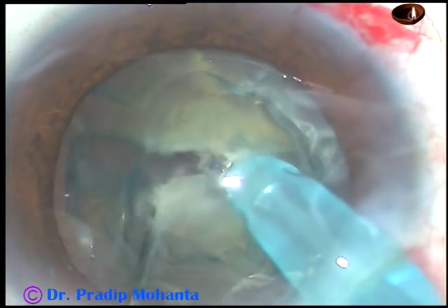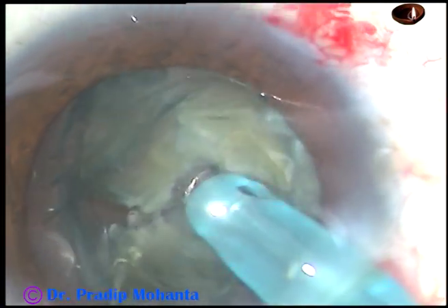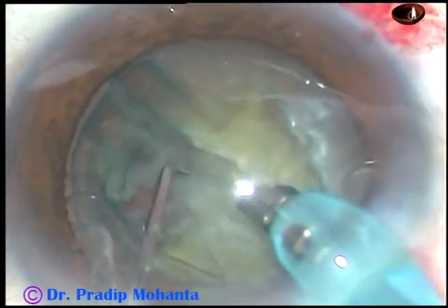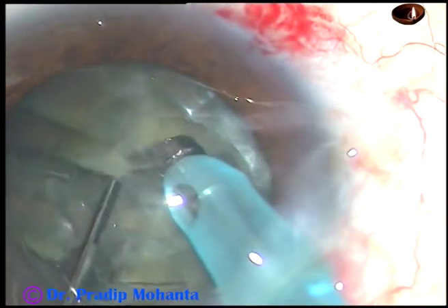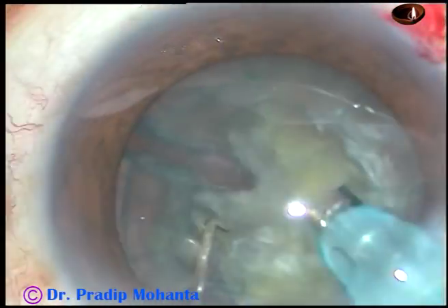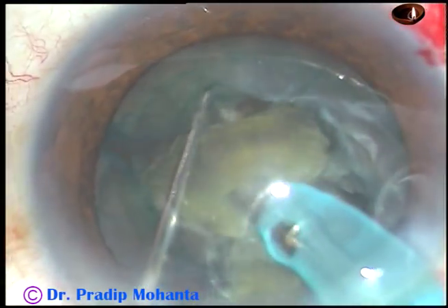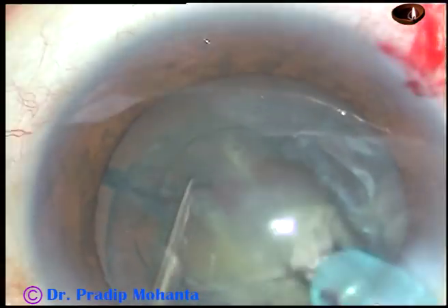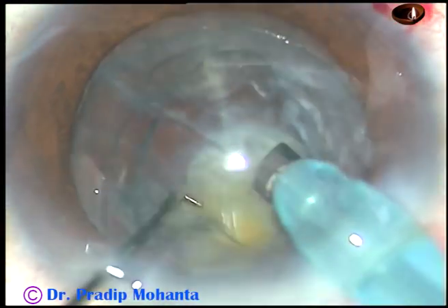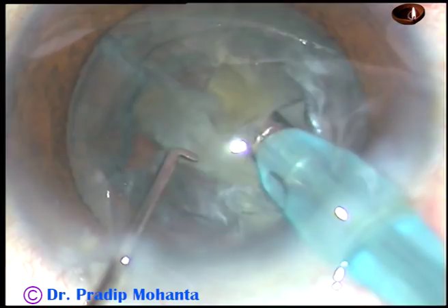I turn the tip towards 3 o'clock and make another chop. This free nuclear fragment is emulsified and removed. I turn the tip towards 8 o'clock and make another fragment. This free nuclear fragment is also removed. The fragment on the other side is free — it is emulsified and removed. Now a piece is there superiorly at 1 o'clock. It is mobilized, brought to the center, and emulsified and removed.